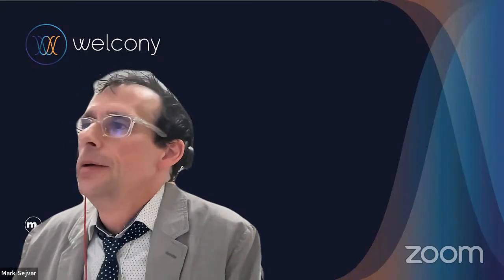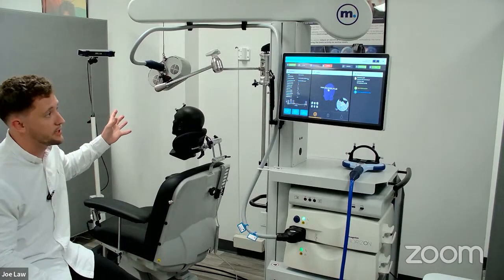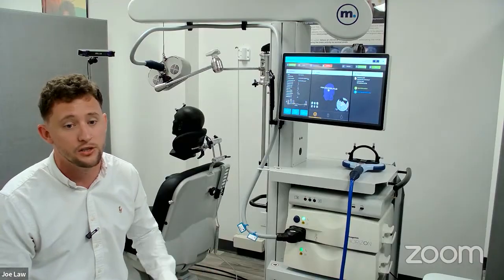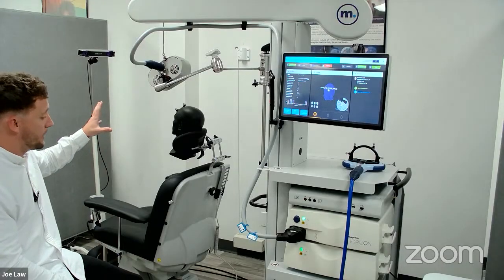Thank you, Joe. Another one has come in. Do the coils overheat when used repeatedly for acute weekday treatment delivery? Great question. So no, they don't. The way our system works, and we did a lot during the design and development here, doing different variations of coils and playing them off against each other, the air-cooled coil wins every time.